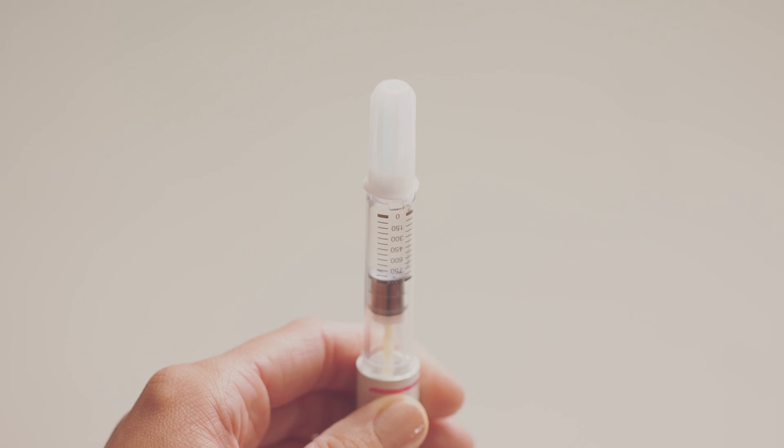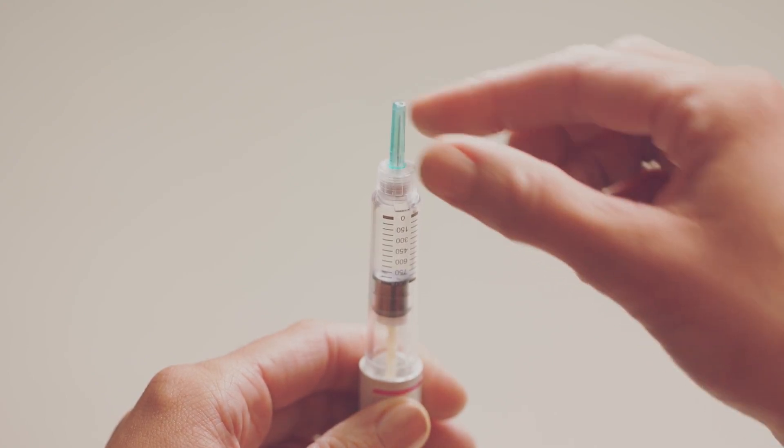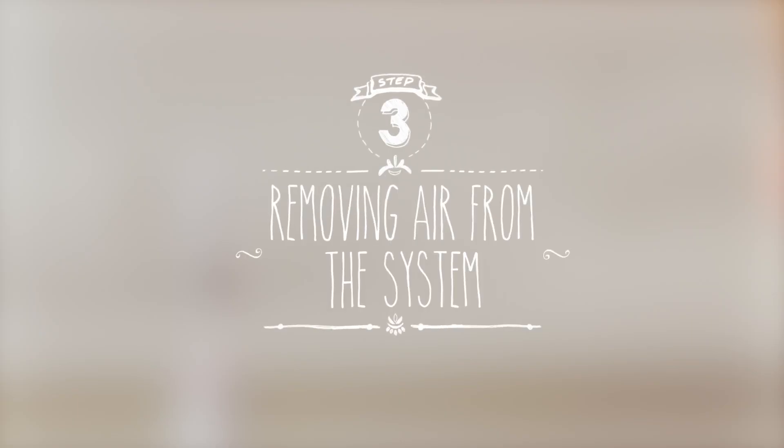Hold your pen with the needle pointing upwards. Pull off the outer needle cap and keep it handy as you'll need it later. Now carefully remove the green inner needle shield and throw it away. Do not recap with the green inner shield. Before using your pen for the first time, you'll need to make sure there's no trapped air. It's not required to check for a droplet of liquid when reusing the pen.